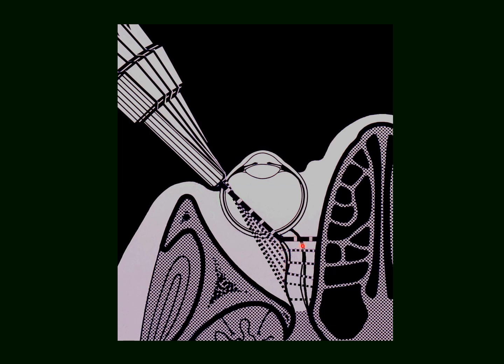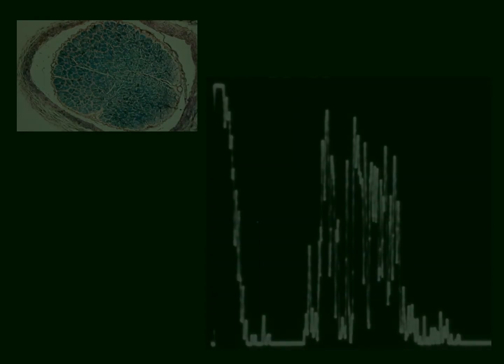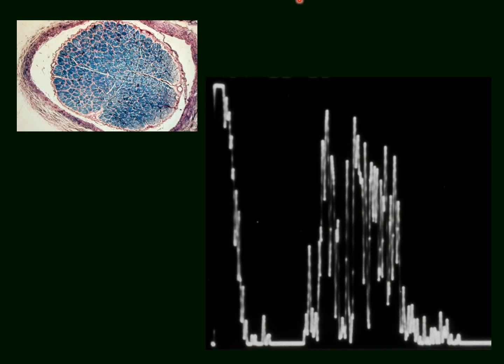Always measure the dural thickness, therefore, at the opposite side, where the beam already arrives perpendicularly. And this is the way these surfaces are recognized and measured. We have here the highest spikes from the arachnoidal surfaces, and their distance gives us the arachnoidal diameter.